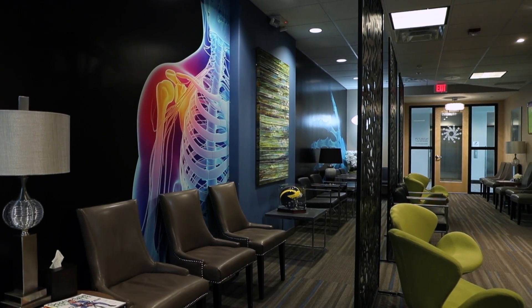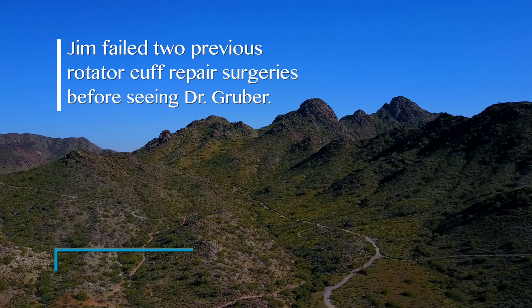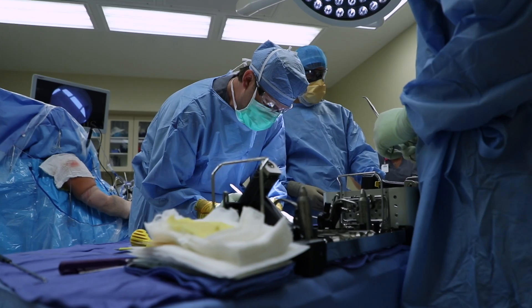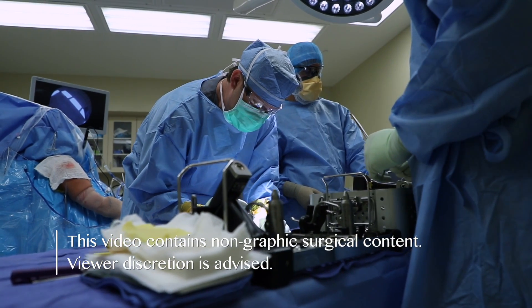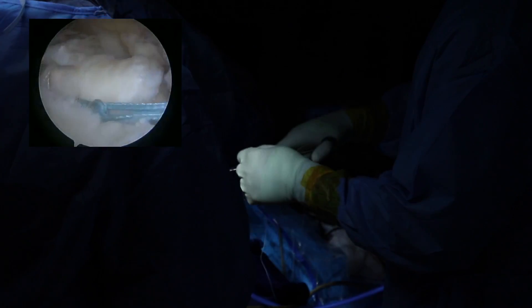The third situation is anytime we have a patient who has come in and failed a previous rotator cuff surgery. The previous orthopedic group that handled the first two surgeries had pretty much scarred and damaged the tissue significantly, and subsequently we decided to go with the graft jacket.